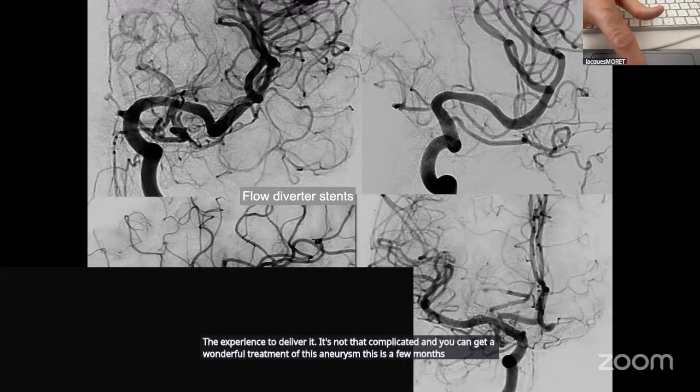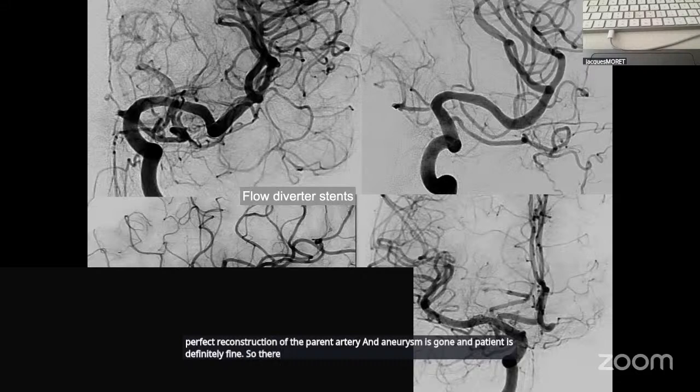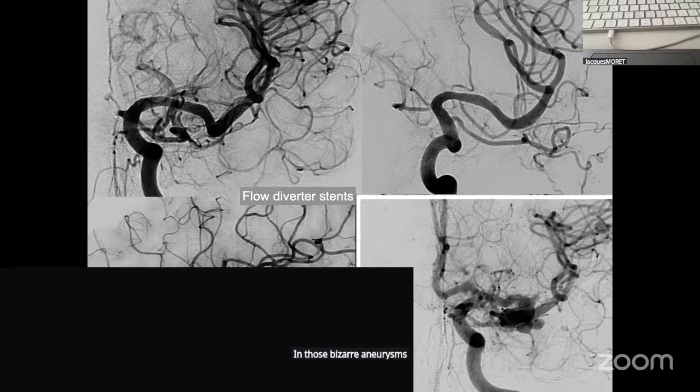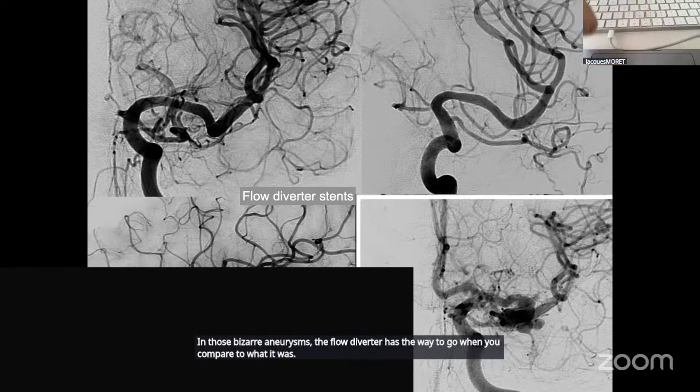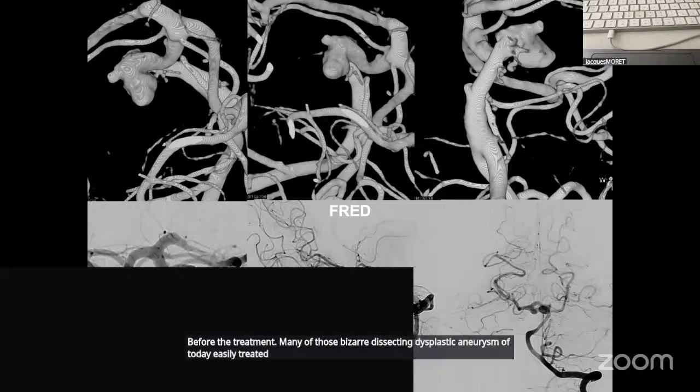You see the perfect reconstruction of the parent artery, and the aneurysm is gone, and the patient is definitely fine. So there is no question that in those bizarre aneurysms, the flow diverter is the way to go, compared to what it was before the treatment. Many of those bizarre dissecting dysplastic aneurysms are today easily treated, easily in quotes.